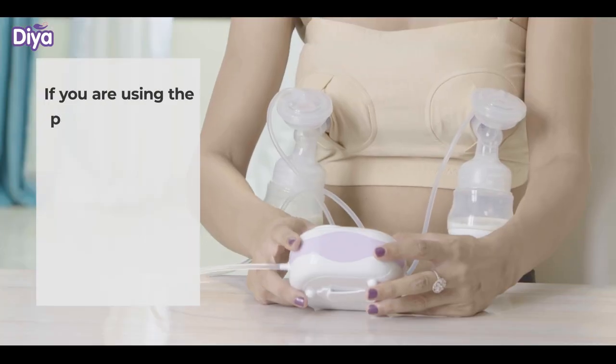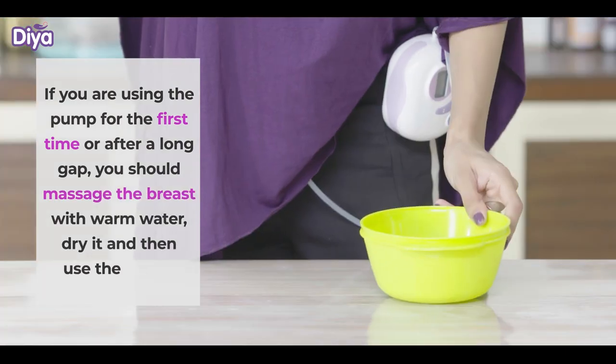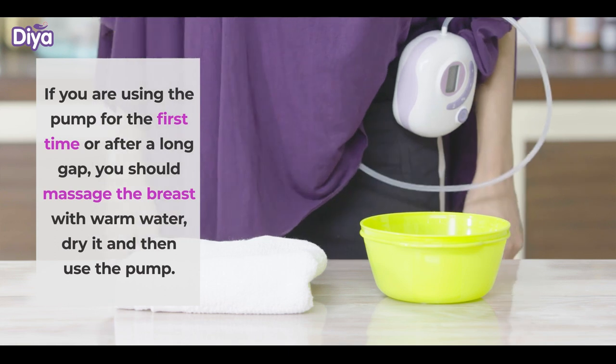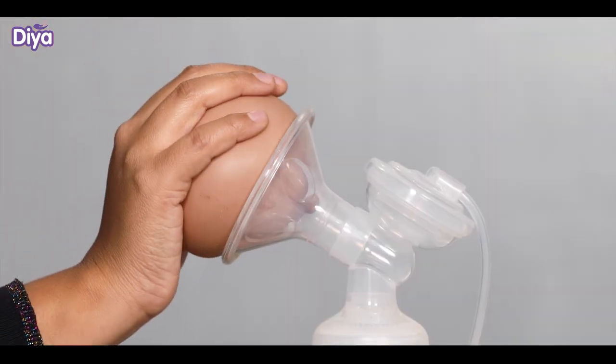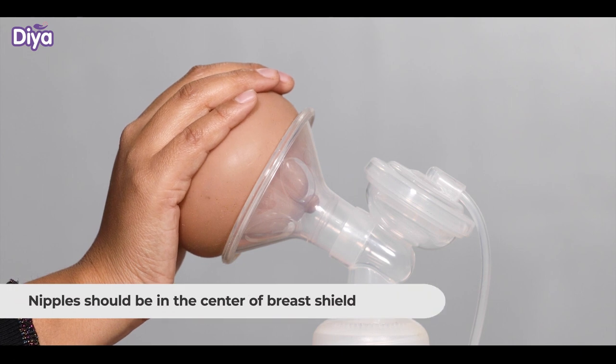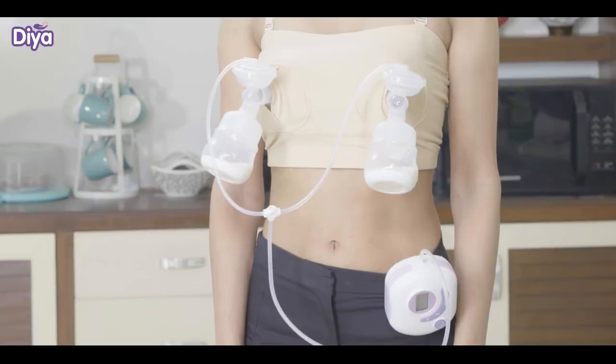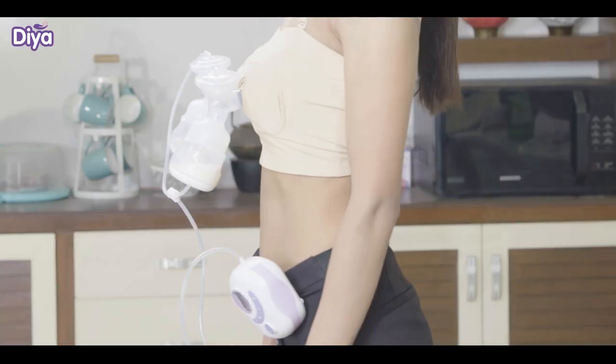If you are using the pump for the first time or after a long gap, massage the breast with warm water and dry it before using the pump. Place the breast shield around the nipple. Ensure that nipples are in the center of the breast shield. Attach the connector with the breast shield. It will look like this. Now it is ready to use.